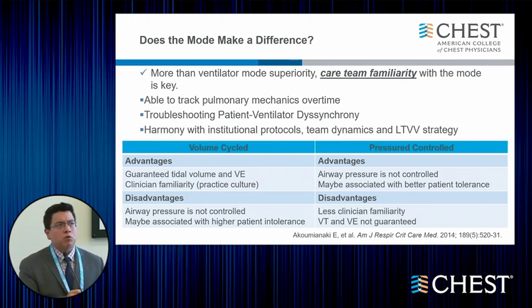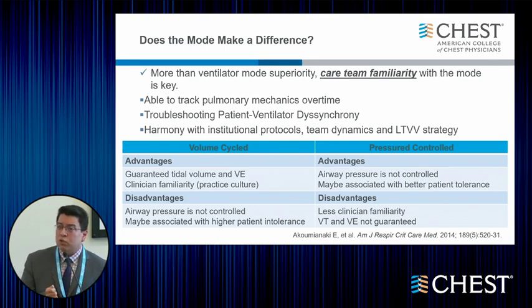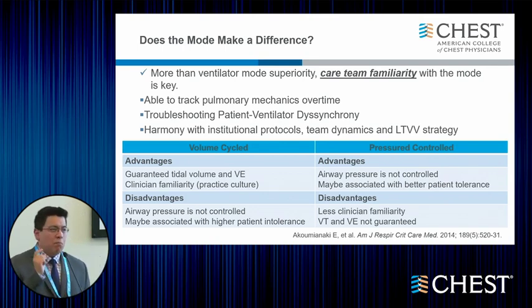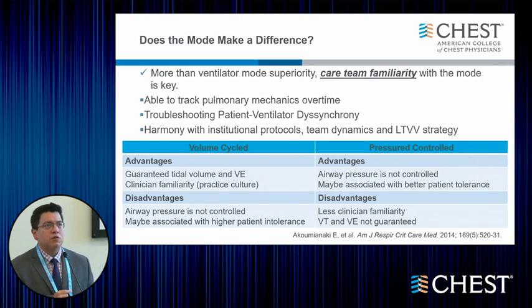For example, volume control will assure a specific minute ventilation and tidal volume over time. It doesn't control the pressure. Having a volume control setting, if inappropriately adjusted, may prompt patient ventilator desynchronies, but perhaps has an advantage over following pulmonary mechanics, as we're going to see shortly.